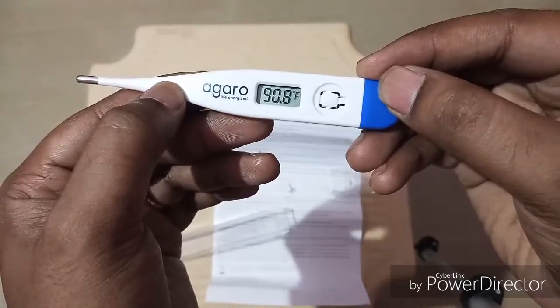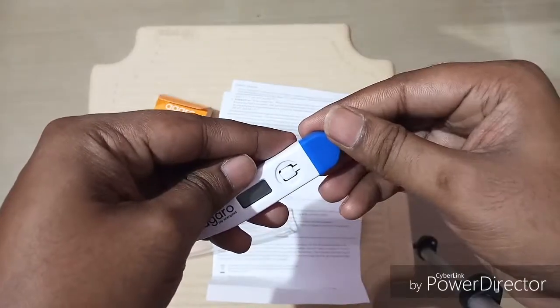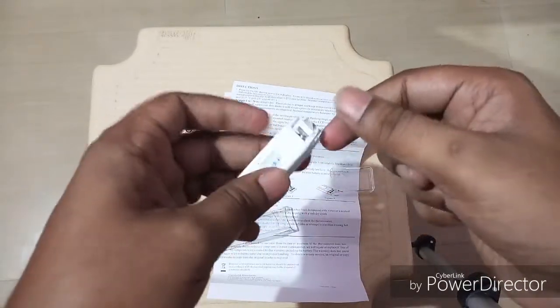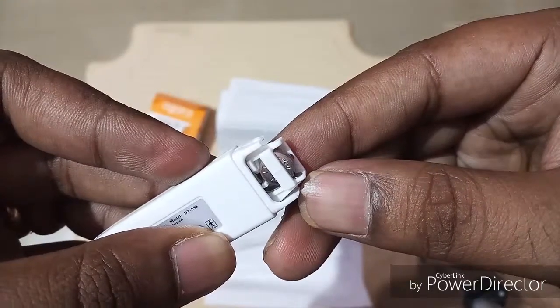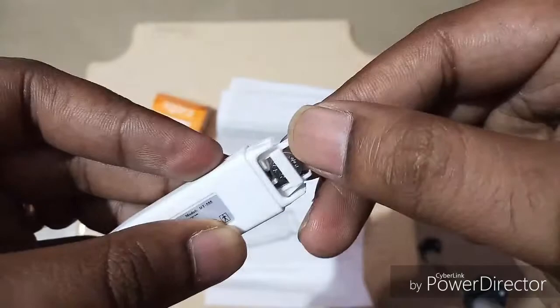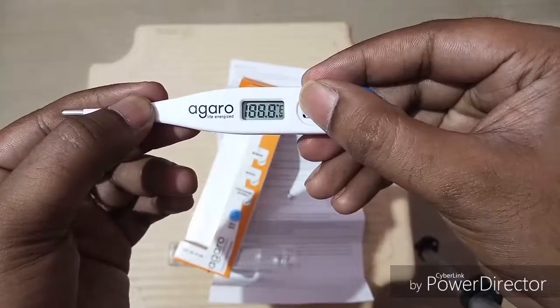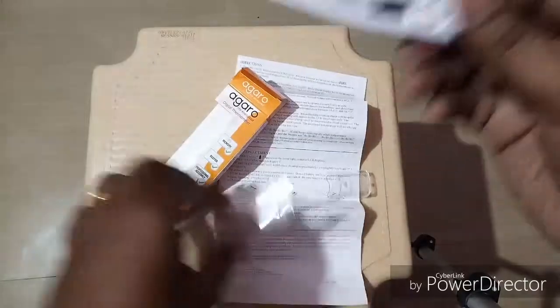Then you can take it out and see the result. To switch it off, just click one more time — it's switched off. It's very simple to use. To replace the battery, just pull the blue cover, remove the small battery inside, insert the new one, and close the compartment. That's it.